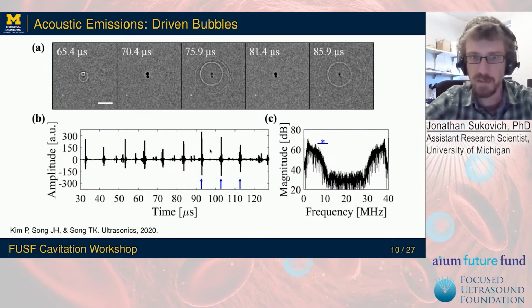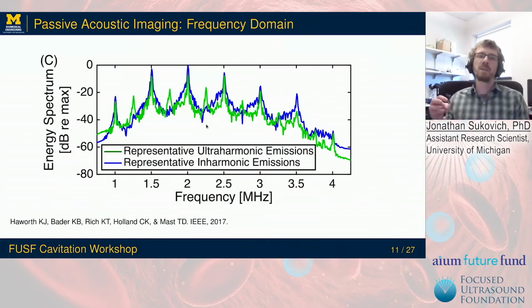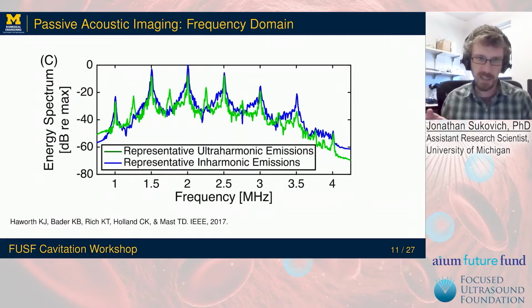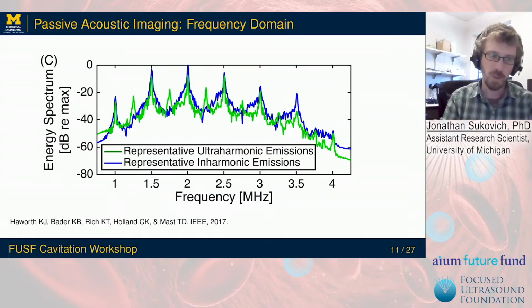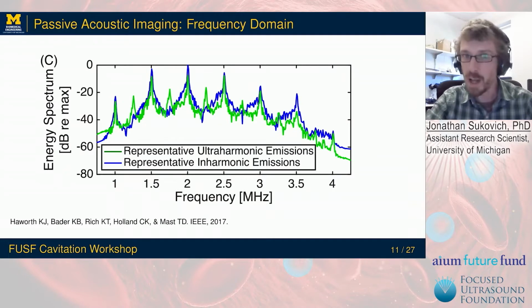And you can see in the received acoustic signal down here that there's this periodic structure of these received signals at the subharmonic of the driving, as well as these signals themselves are just broadband shockwave signals. And a nice thing about these passive imaging techniques is that because the dynamics of the bubble are known, and we know that we're going to get subharmonics or broadband noise, we can frequency filter out the fundamental driving frequency of the incoming acoustic pulse, histotripsy pulse, to isolate the cavitation signal in order to localize it.